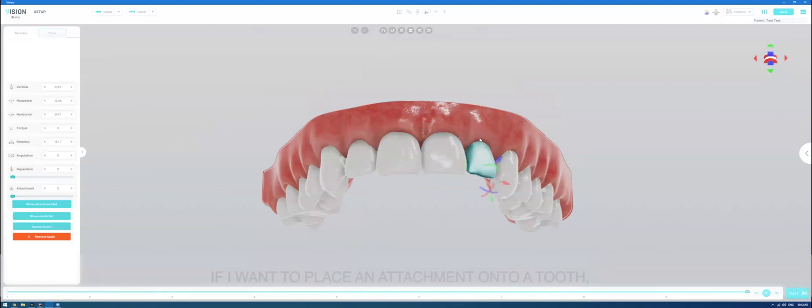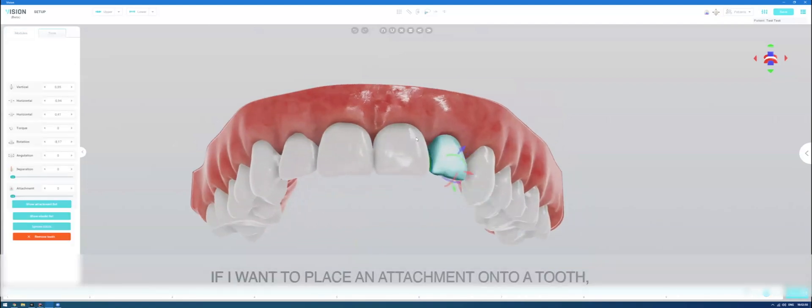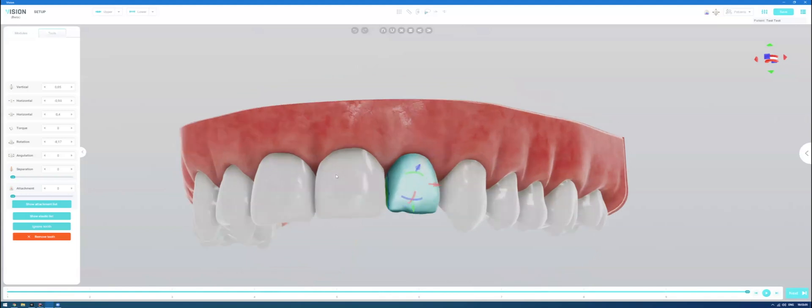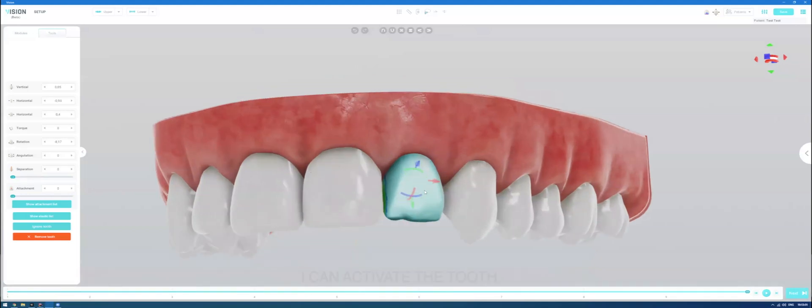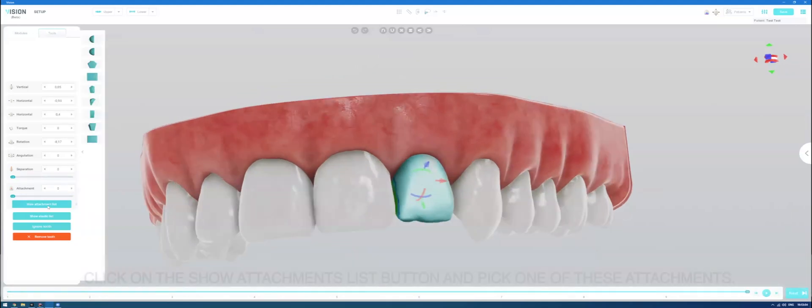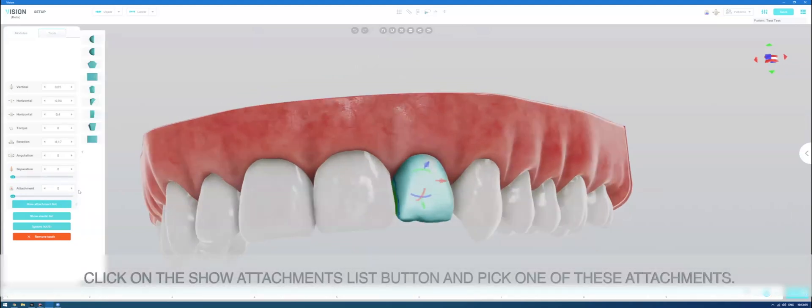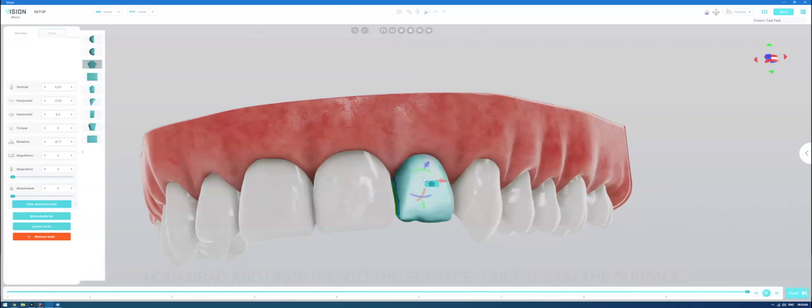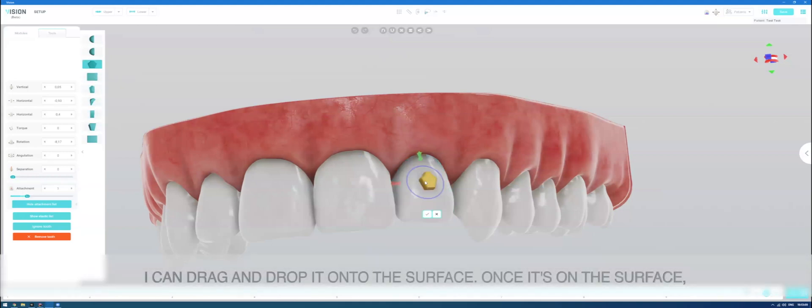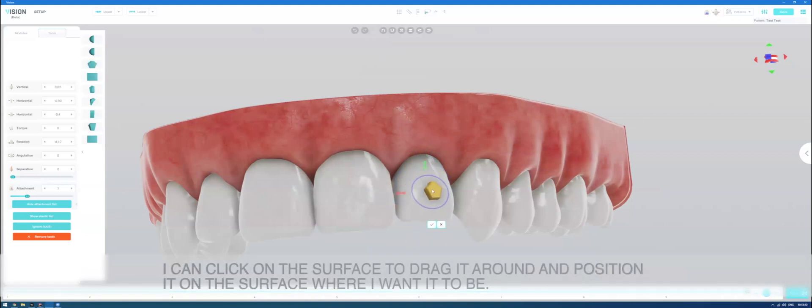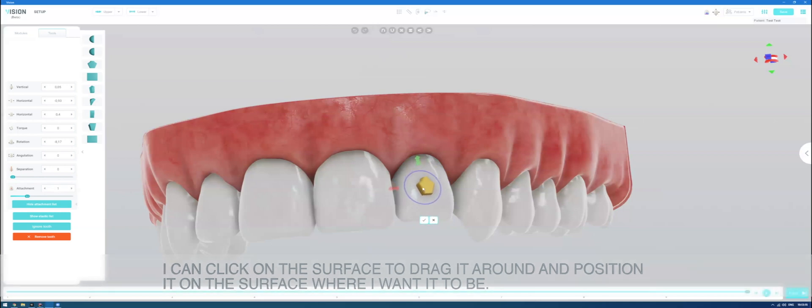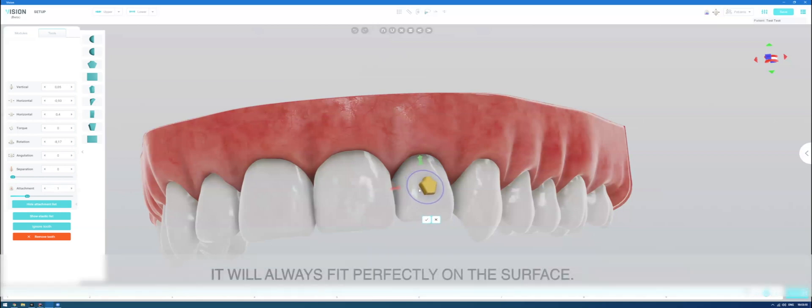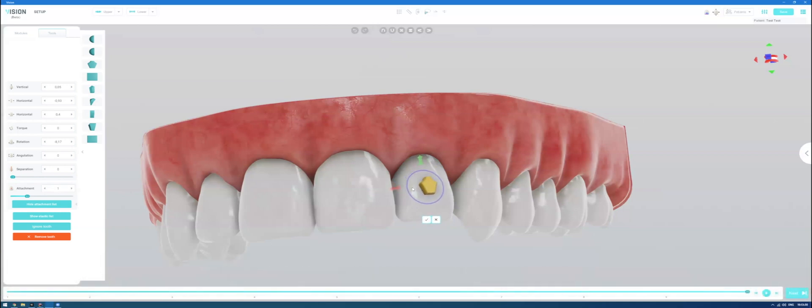If I want to place an attachment onto a tooth, I can activate the tooth, click on the show attachment list button and pick one of these attachments. I can drag and drop it onto the surface. Once it's on the surface, I can click on the surface to drag it around and position it on the surface where I want it to be. It will always fit perfectly on the surface.